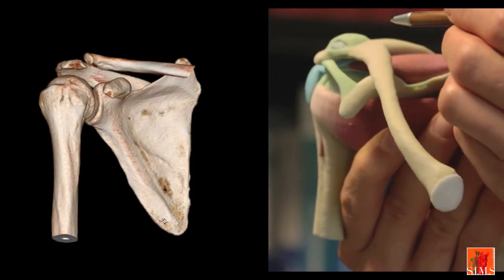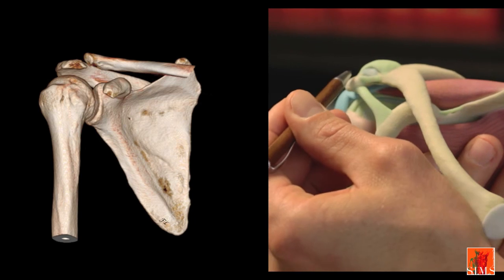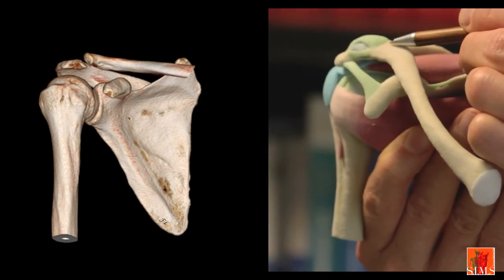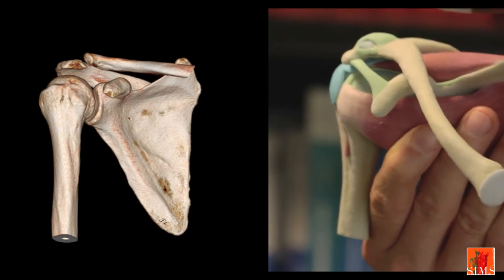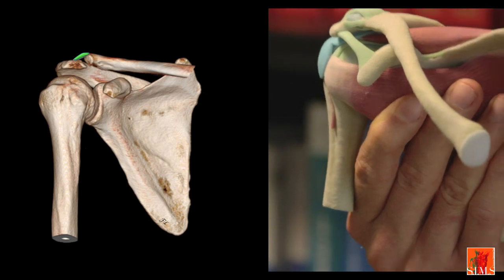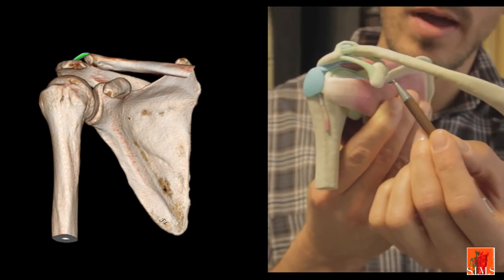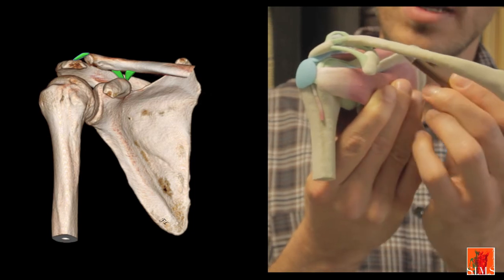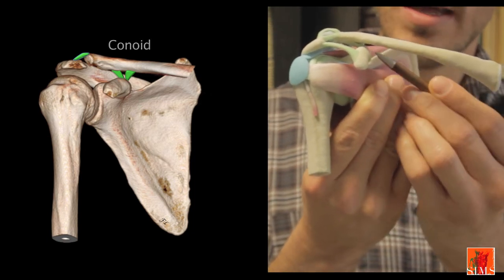The acromioclavicular joint binds the medial border of the acromion on the one hand, with the distal end of the clavicle on the other hand. The stabilizing components include a powerful acromioclavicular ligament, which is located superiorly, and two coracoclavicular ligaments stretching between the coracoid process and the clavicle, consisting in a conoid ligament and a trapezoid ligament.